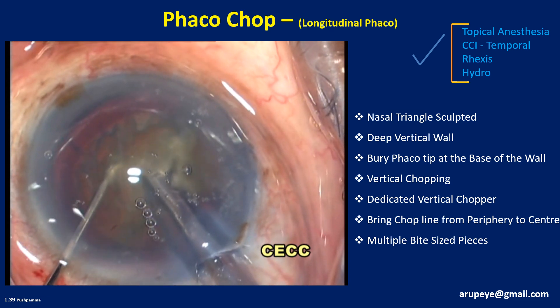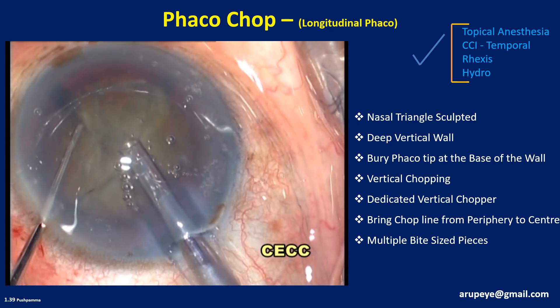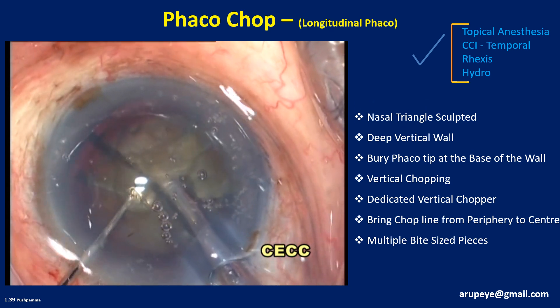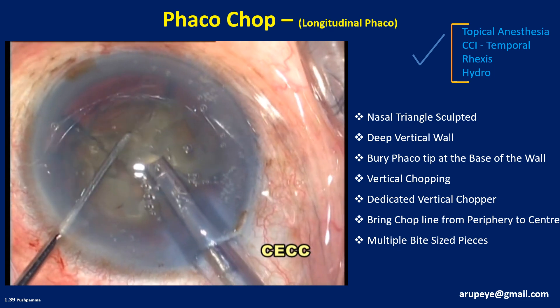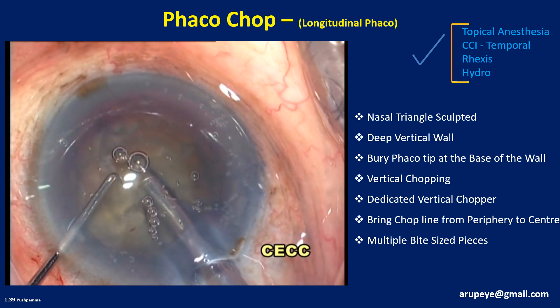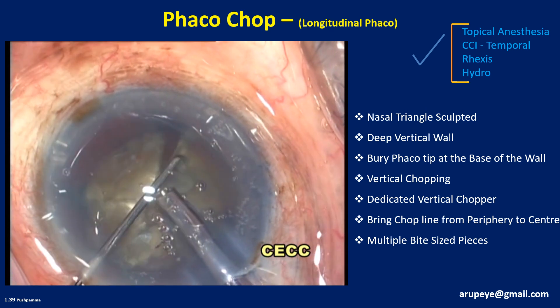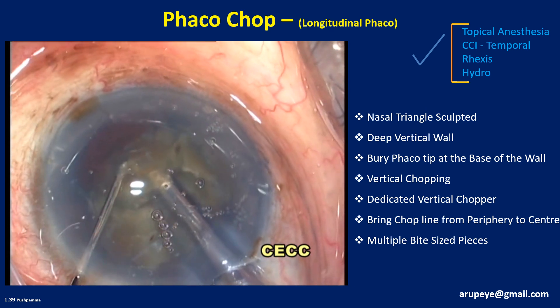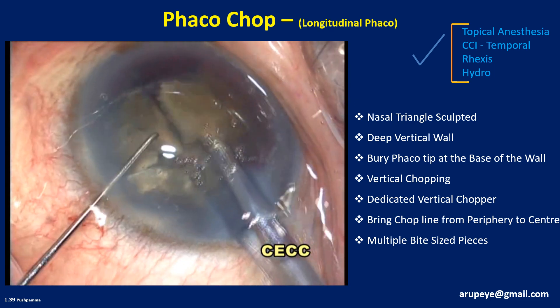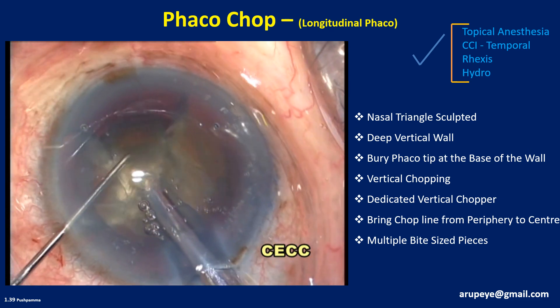The nucleus is rotated 30 degrees for sequential chopping, and this maneuver will be repeated till the entire nucleus is chopped into multiple fragments. Harder the nucleus, more the number of fragments. It may be necessary to apply an additional buzz of phaco power for deeper impalement of the tip for enhanced purchase on the nucleus to prevent it from getting dislodged. I prefer to disassemble the nucleus completely before consuming the fragments. However, in certain situations, the first fragment may need to be consumed as soon as it is generated to create more space in the capsular bag for safer nuclear manipulations.